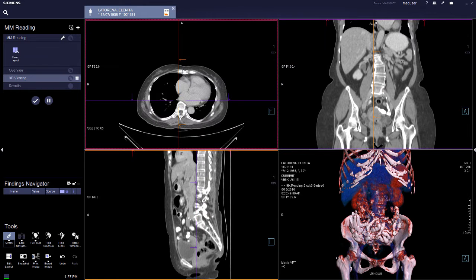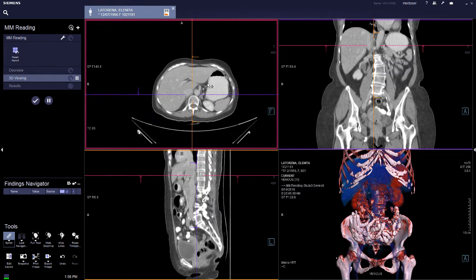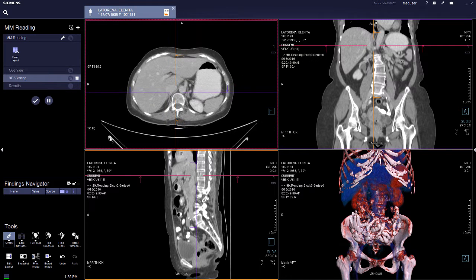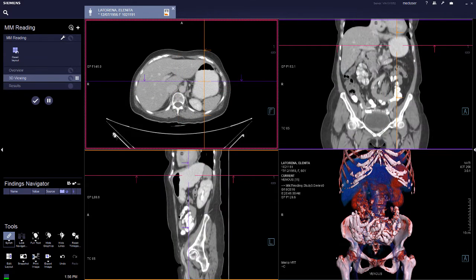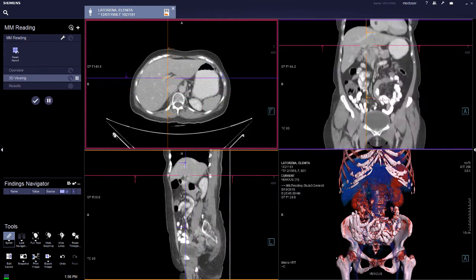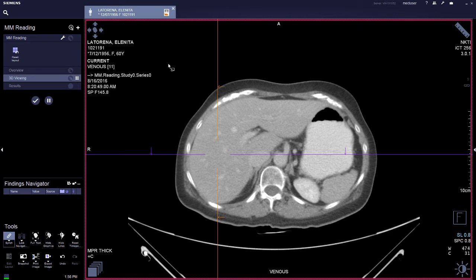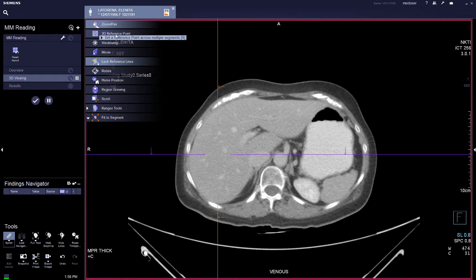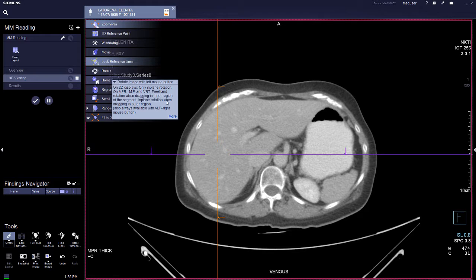Right mouse click, pull, and move is for scrolling. When the mouse is in the image, left mouse click is for panning, and outside the image is for zooming. The crosshair allows visualization of particular points. All tools are available in the four corners — clicking on a tool will give a brief summary of what it does.